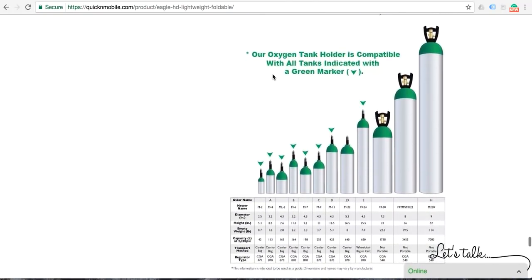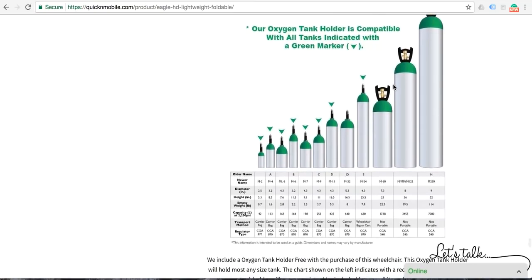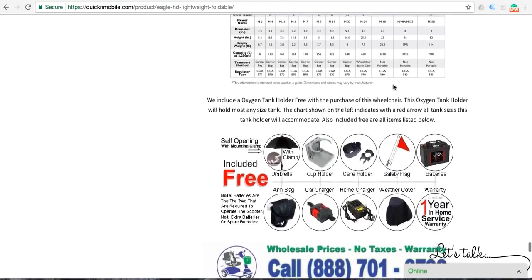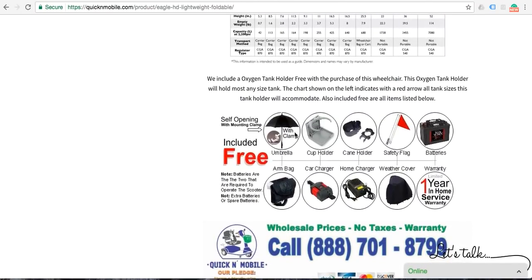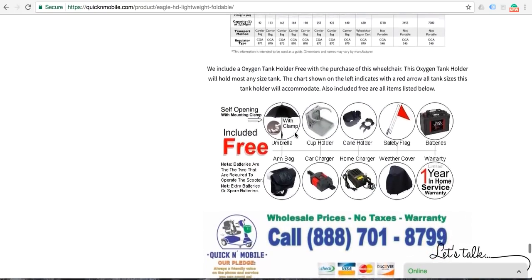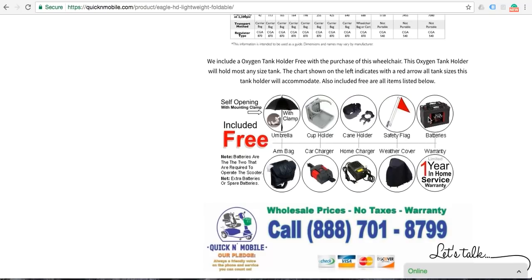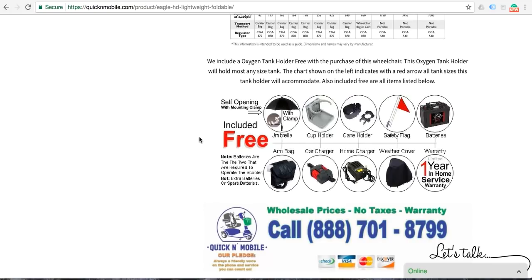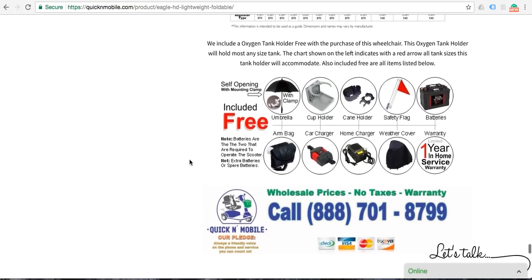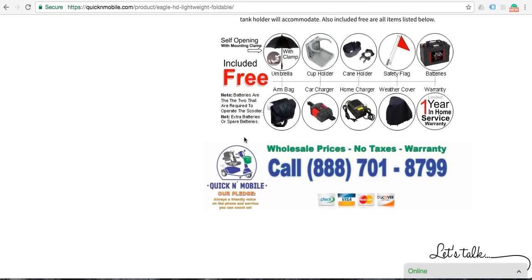This portion of the website goes over some of the free accessories: the oxygen tank holder is one of the accessories that we automatically include. Additionally we include an arm bag, a car charger, a home charger, we actually include a weather cover, we include an additional battery, we include a safety flag, we include a cane holder, we include a cup holder, and we include an automatically opening umbrella with a mounting clamp. And you can see right here our telephone number, 888-701-8799.